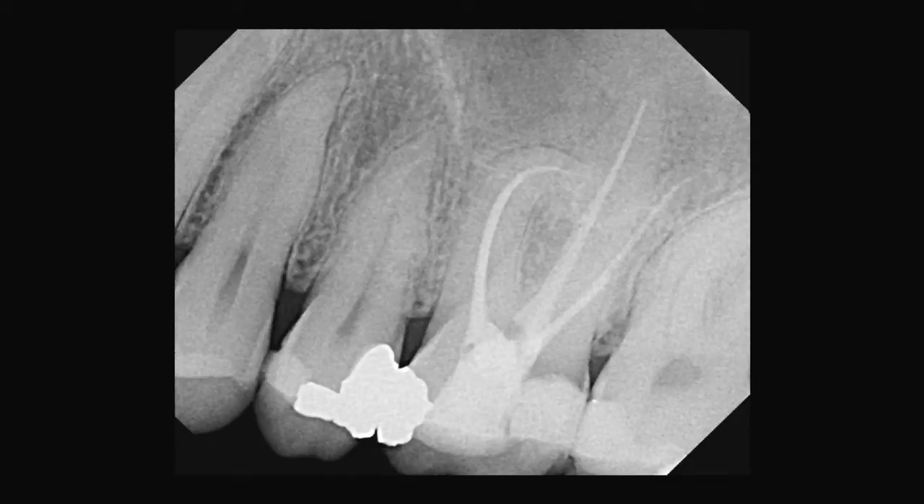Three-dimensional obturation — I get so excited when I see this. This case is very familiar to somebody in the room because it's a molar that I retreated for them; they flew all the way to Whitefish just to have this done. Their tooth was failing, so we went ahead and PIPSed it and re-treated it. Teeth like this with big curves — PIPS makes it very simple and gives confidence that you can get around those curves and clean them out.